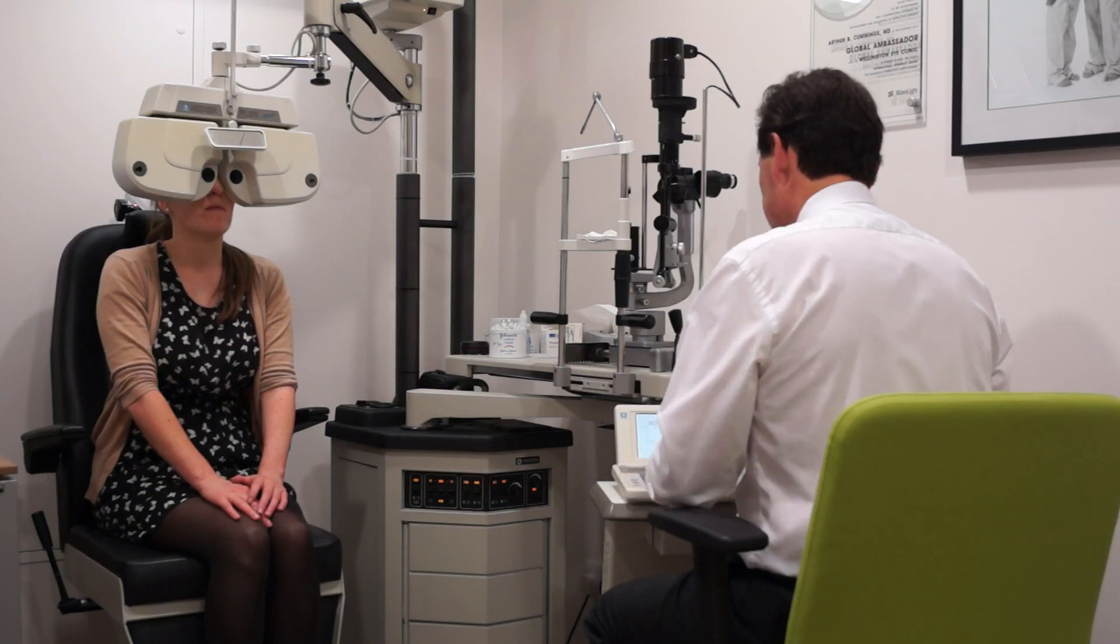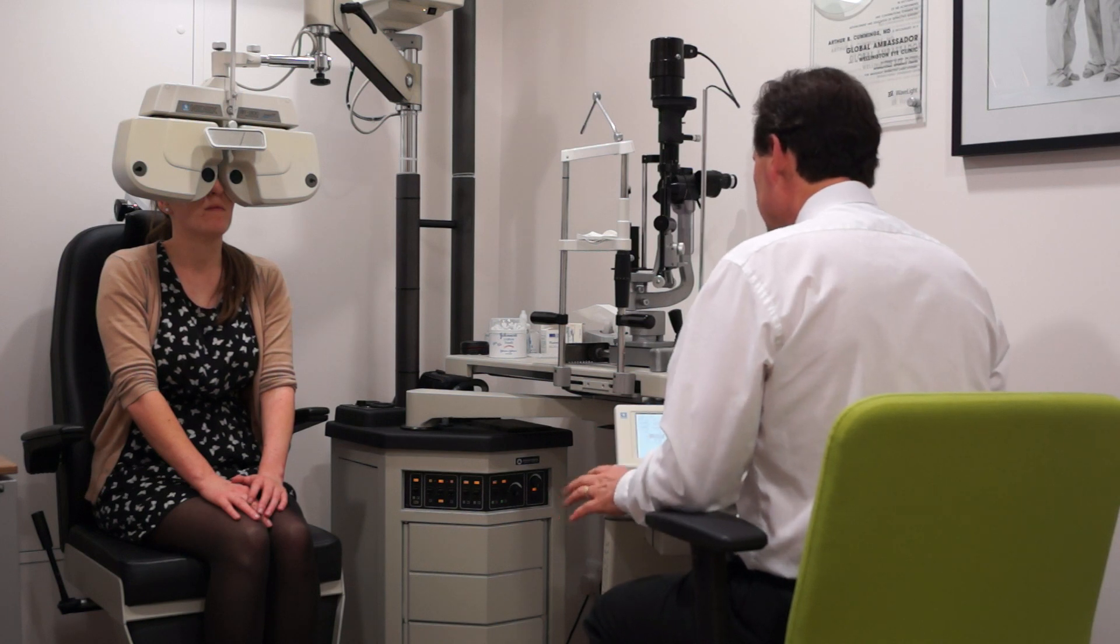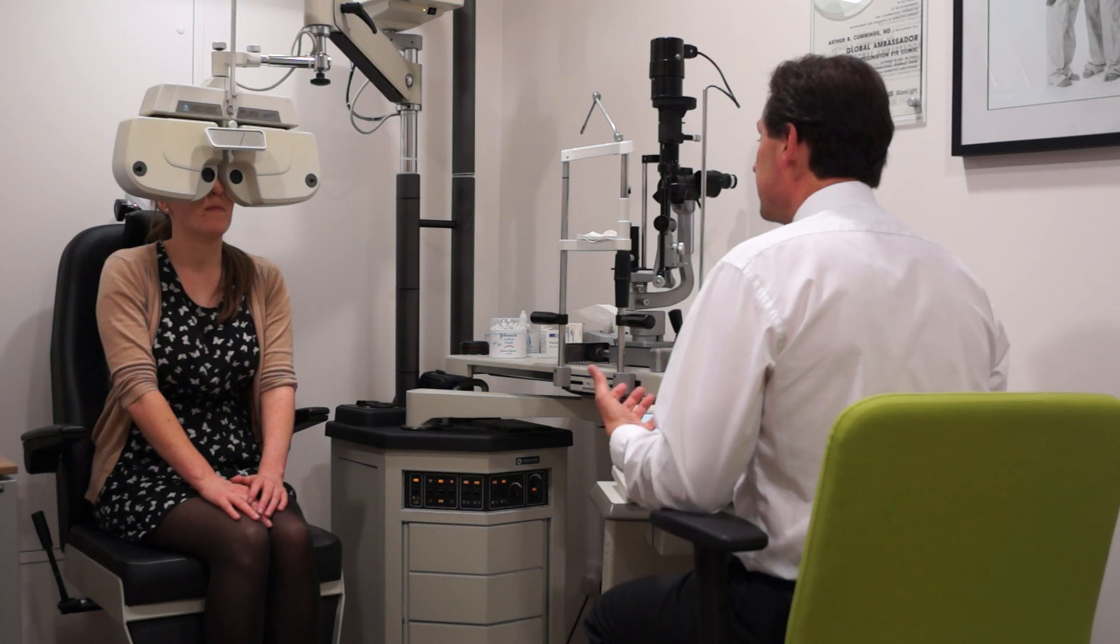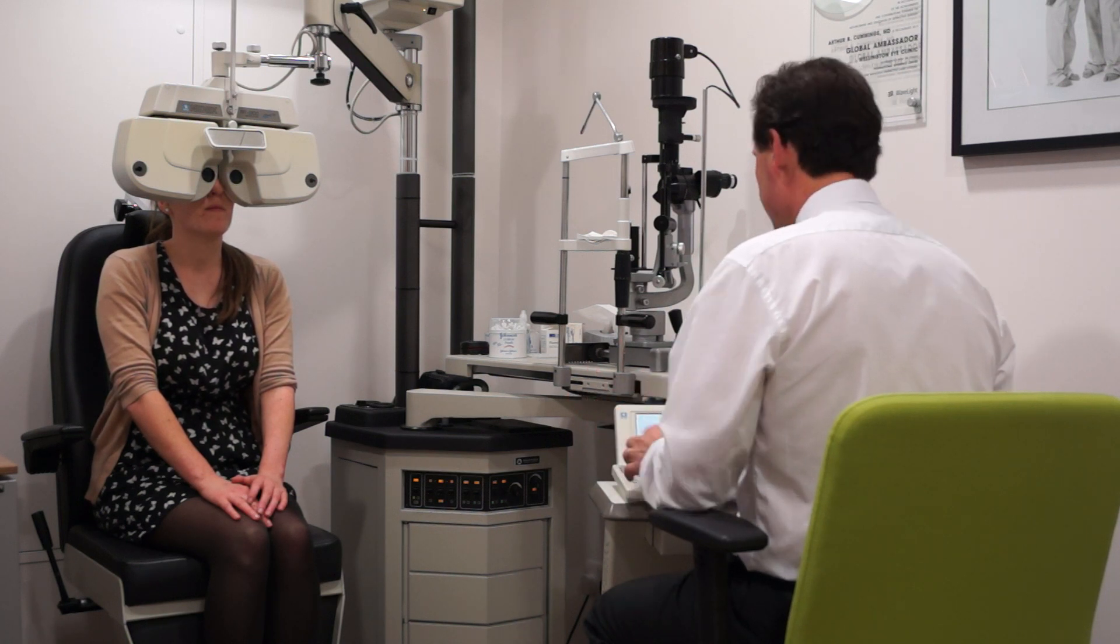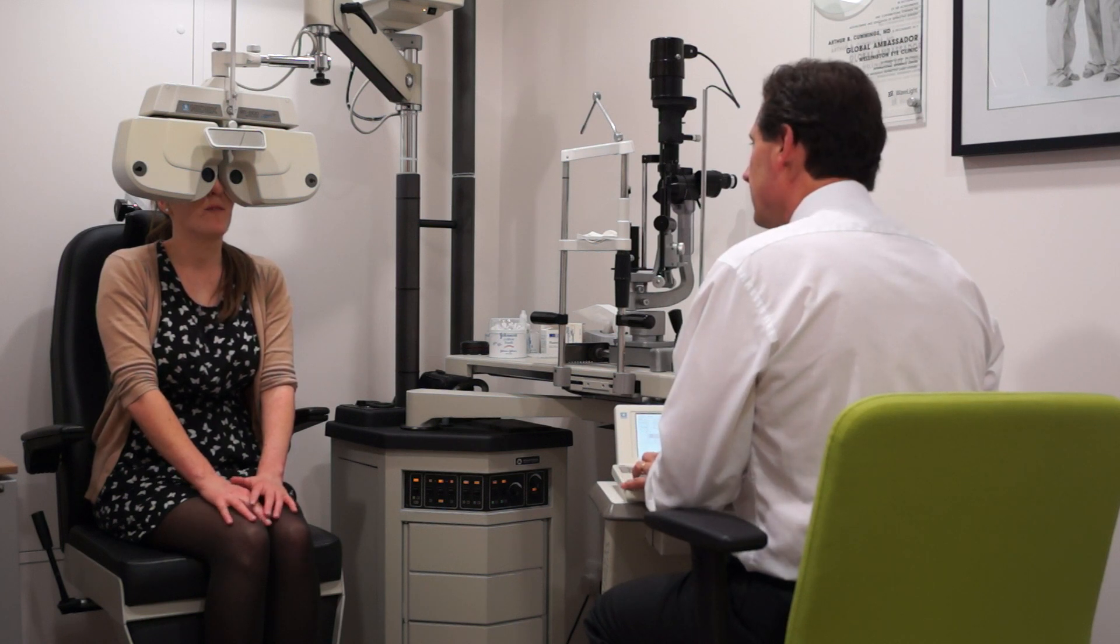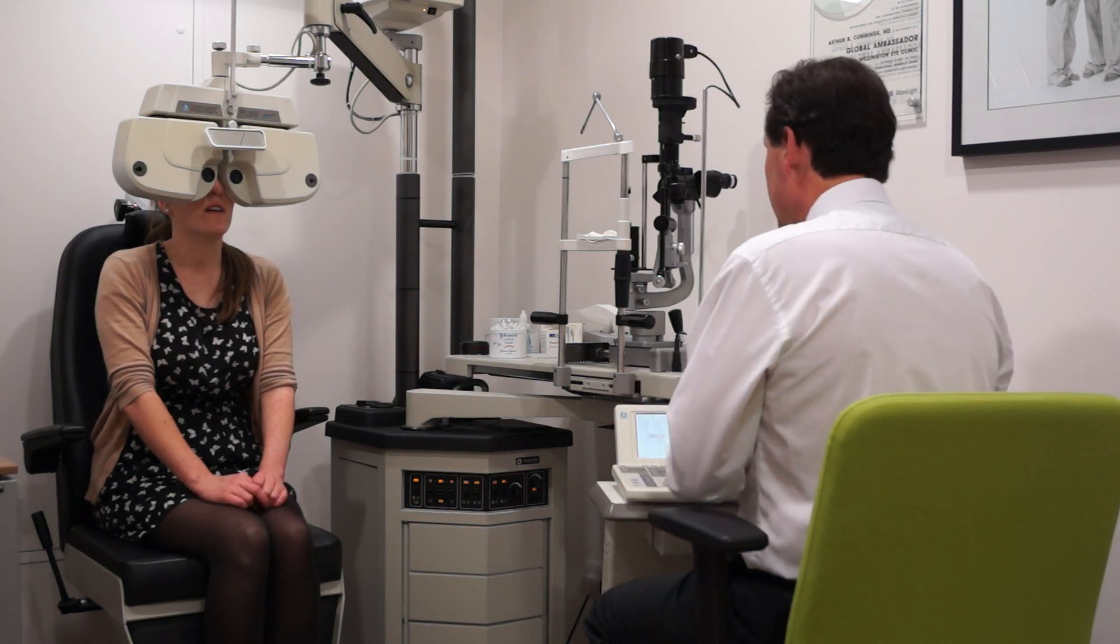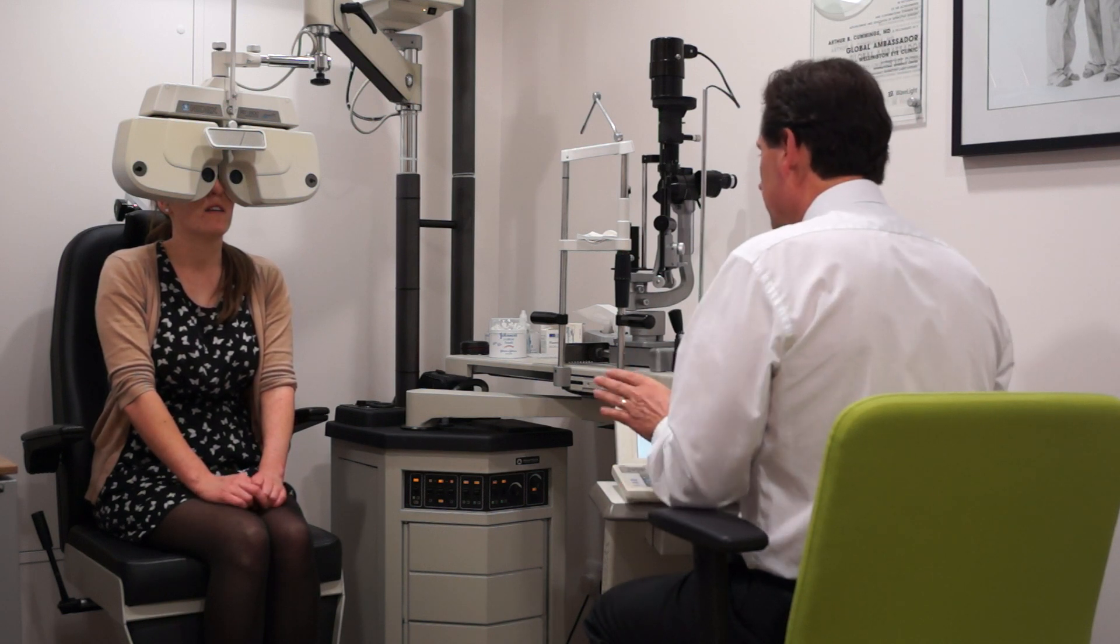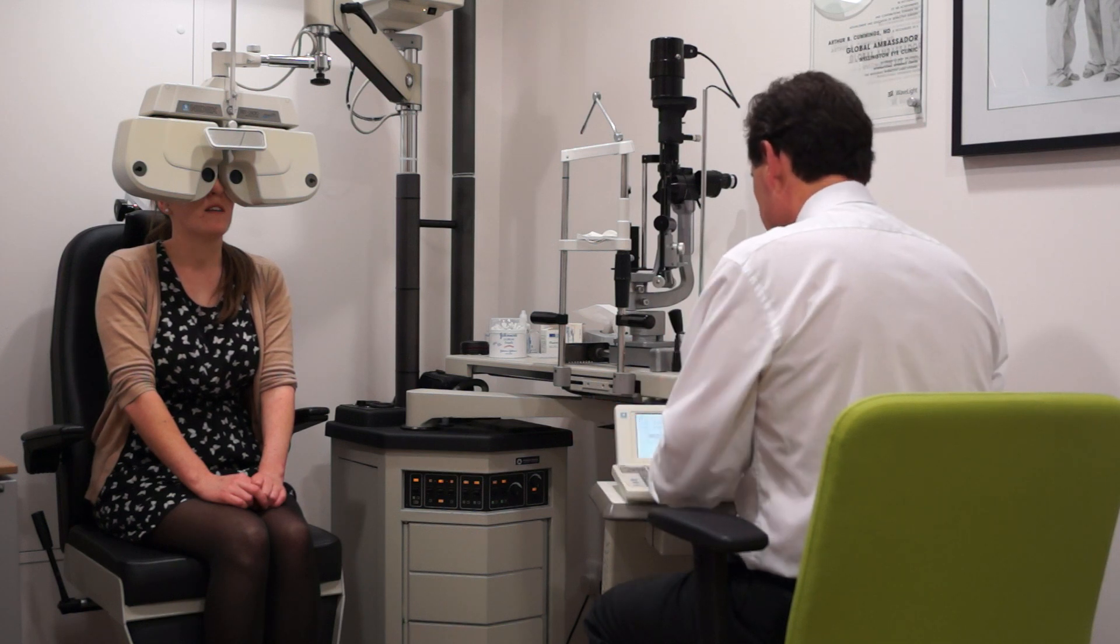This is your distance fixation disparity. How many red lines do you see? Four. All four. Right. So that means both eyes. The two eyes are dissociated, yet the brain's using both. And the four lines, do they form any particular shape? They form a cross. A little cross. All right. Perfect. So even though the two eyes are dissociated, the brain's still ensuring your eyes are aligned. So your eyes are perfectly straight.